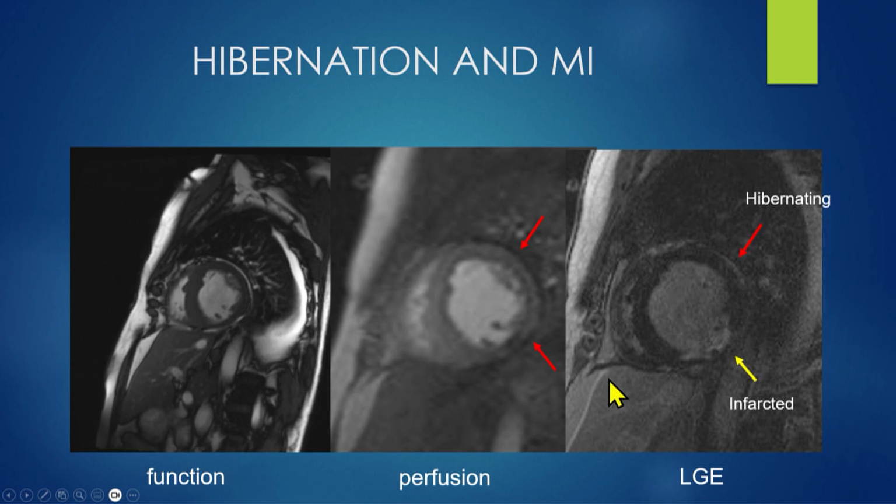And if you look at the delayed image, there's an area, segmental, there's an area of infarction here, but there's an area which is abnormal in the other 2 things, but not here. So there's both hibernating and infarcted myocardium. So we can make that distinction, actually.